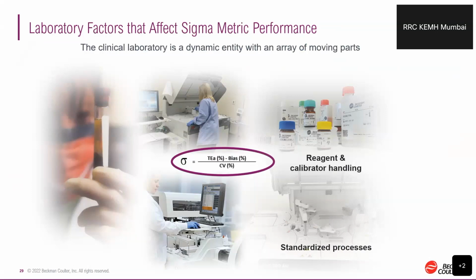If those calibrations are not being done as required, your calibration need is a result of drift in your analyzer components, or maybe the reagent deterioration. These are two main factors. So how do we calibrate? We use some standard material. We tell the instrument that its value is 100, for example. So give me a value of 100.